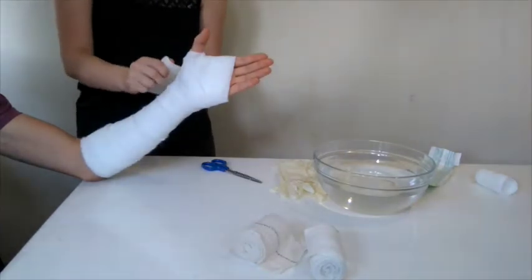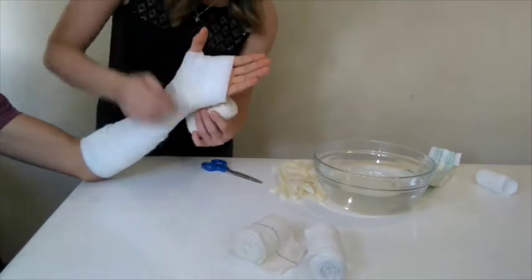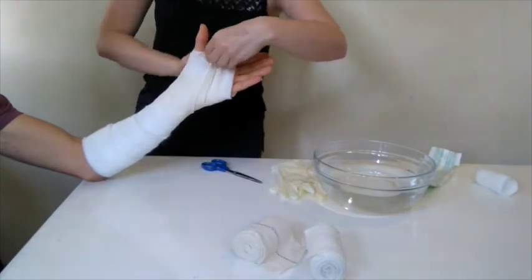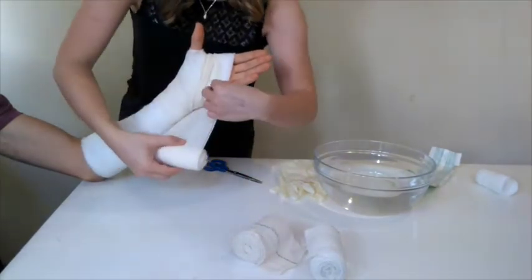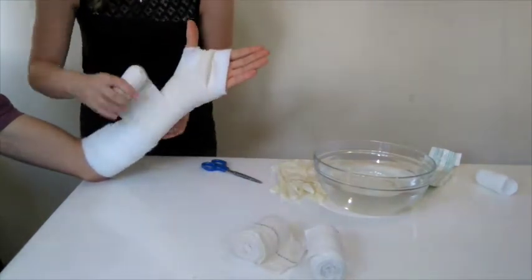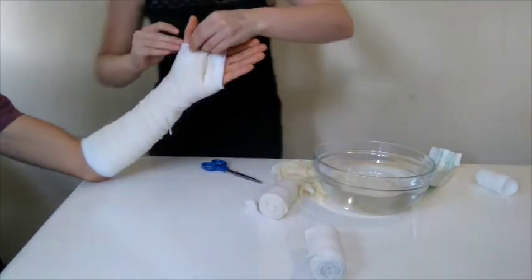Start applying the bandage at the wrist and move distally, rolling it onto the arm instead of pulling it to avoid additional pressure. There are two methods for getting a good fit around the first web space: either twisting the bandage or pinching it. This is repeated twice before moving towards the elbow, again with a 50% overlap. Do not apply the plaster of Paris all the way to the end of the padding as this will make for a hard edge.